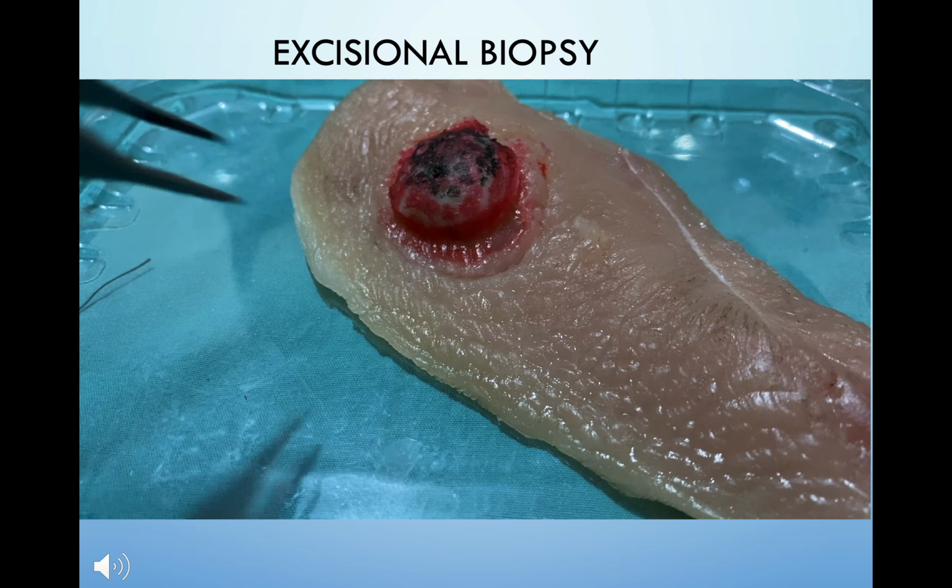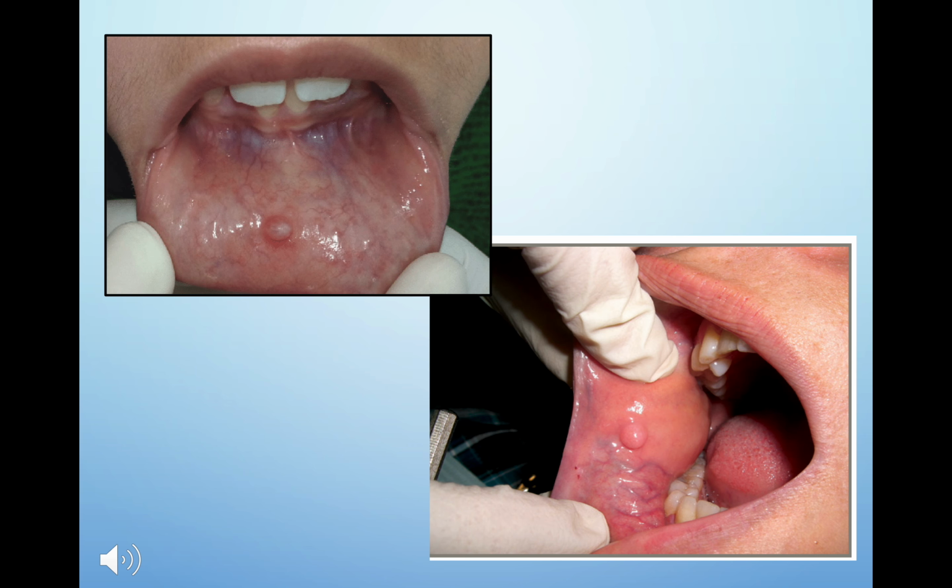Occasionally, when we use electrocautery or laser for excisional biopsy, we expect there will be some thermal damage. Therefore, a 0.5 mm margin should be maintained between the cut and the representative area to be sampled. If you happen to encounter the lesions as shown in the picture, for example, you suspect mucocele or a fibroepithelial polyp, excisional biopsy can be done.